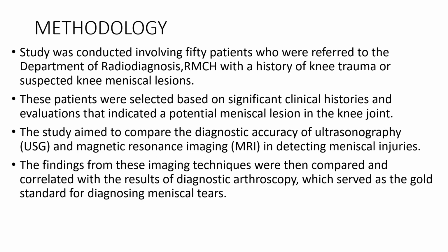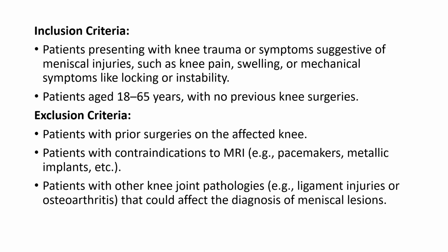The study was conducted involving 50 patients who were referred to the Department of Radiodiagnosis with a history of knee trauma or suspected knee meniscal lesion. These patients were selected based on significant clinical histories and evaluation that indicated a potential meniscal lesion in the knee joint. The study aimed to compare the diagnostic accuracy of ultrasonography and MRI in detecting meniscal injuries, and findings from these imaging techniques were compared and correlated with diagnostic arthroscopy, which served as the gold standard.